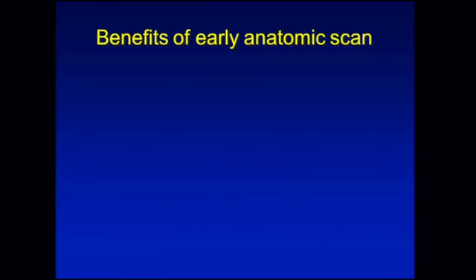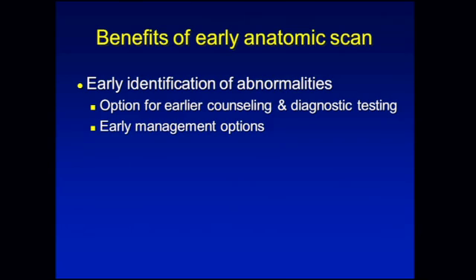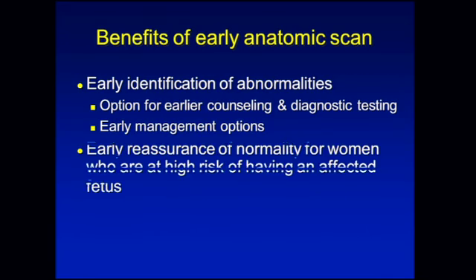What are the benefits of the early anatomy scan? Well, early identification of abnormalities allows the option of earlier counseling and diagnostic testing, as well as early management options. For women who are at high risk of having an affected fetus, a normal first trimester scan could provide them early reassurance.